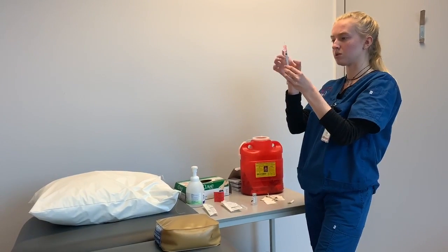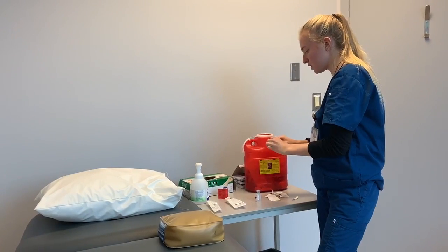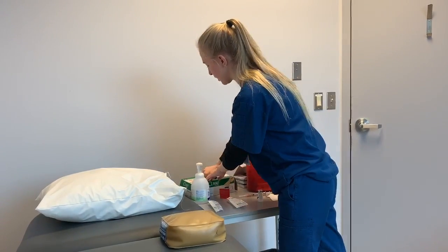And just get all the air bubbles out. I'm going to recap the needle and perform hand hygiene again. And now I'm going to put on gloves.